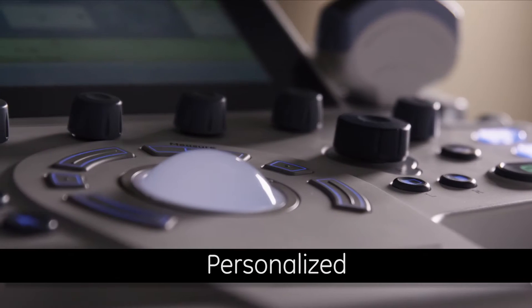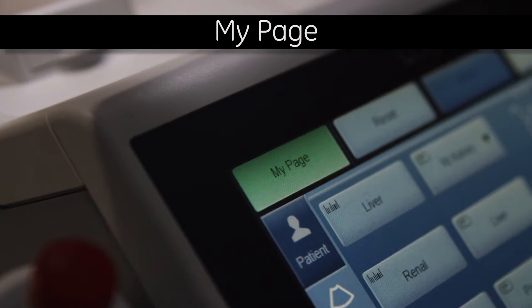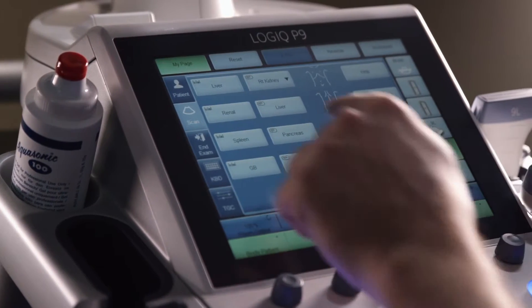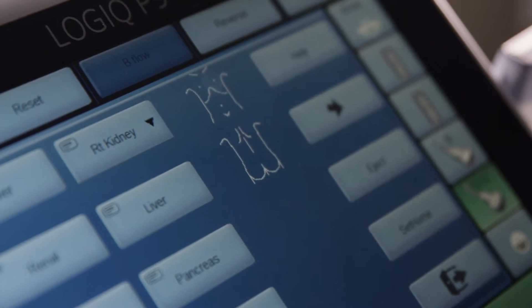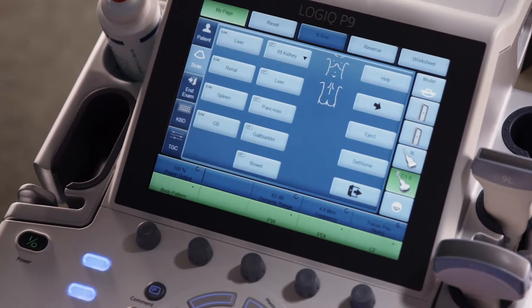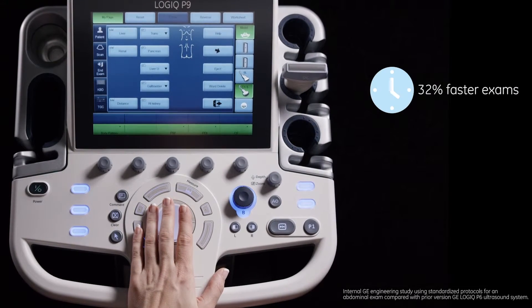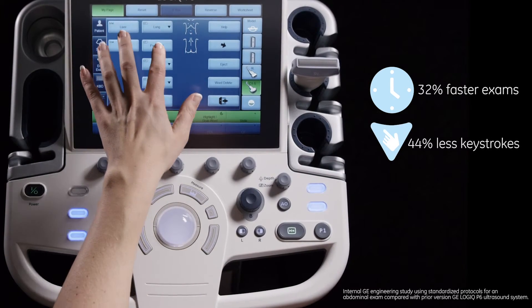Beyond the simplicity of its console design, the Logic P9 has a customizable digital user interface called MyPage. With MyPage, each user can customize and save workflow preferences. The preferences populate the large touchscreen with use case presets, including measurements, body patterns, comments, and functions. MyPage has been shown to improve abdominal exams with 32% reduced exam time and 44% reduced keystrokes.